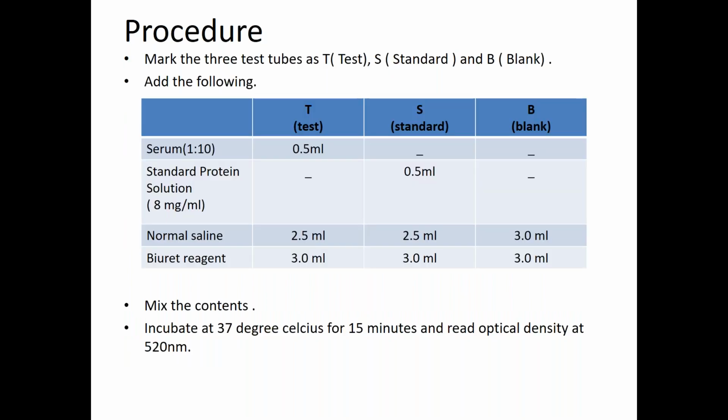So, coming to the protocol. This protocol is different from the manual, so please note it. You have to follow this protocol during your practical and during your exam, and it is different from what is given in your manual. First, take three test tubes and mark them: T for the test solution, S for the standard, and B for the blank.